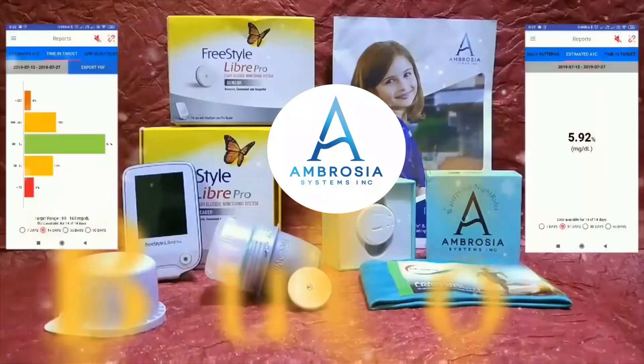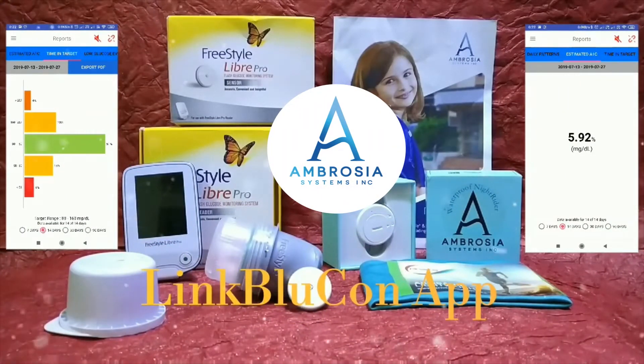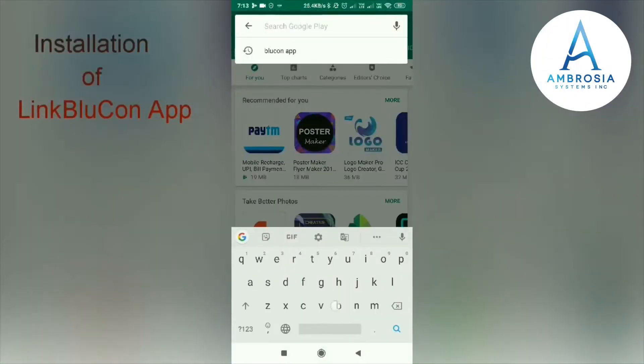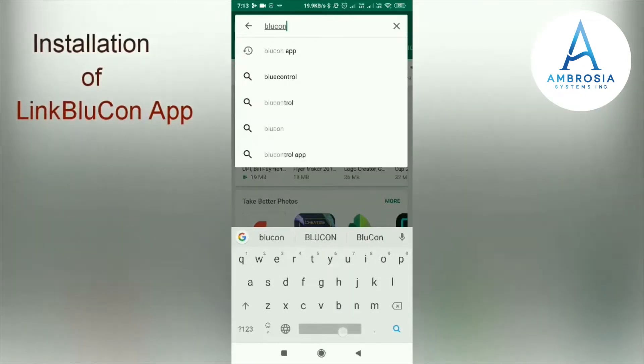Hi viewers, in this video we will install the LinkBluCon app on our Android phone and connect the Ambrosia BluCon NightRider to the LinkBluCon app. Search for 'BluCon app' or 'LinkBluCon app' in the Play Store.